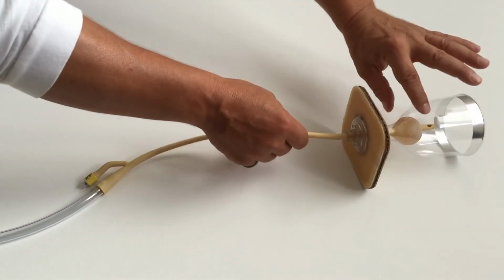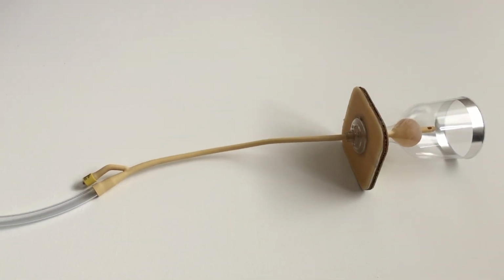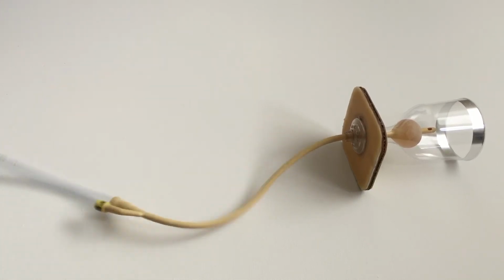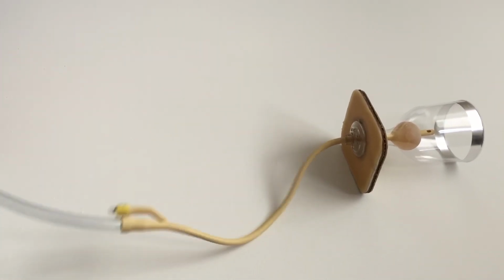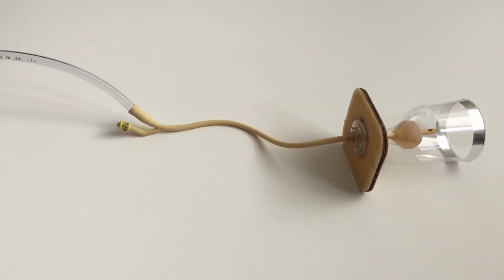Now, with the SupraCath positioning adapter here, it doesn't matter how much the catheter or drainage bag is moved. There is no movement of the catheter within the patient, maintaining the seal with optimal functioning positioning. Quite a difference that translates to an all-around, game-changing world of difference for the patient.